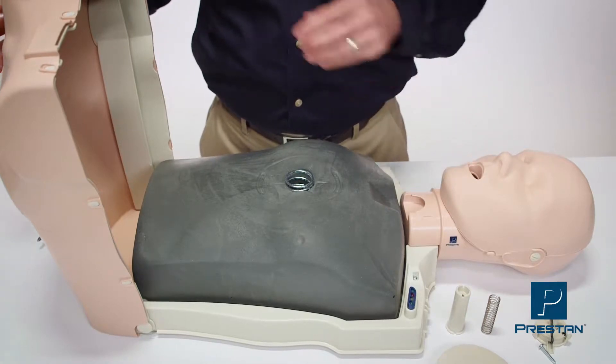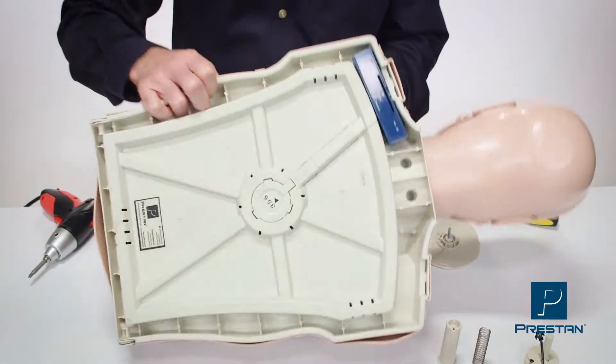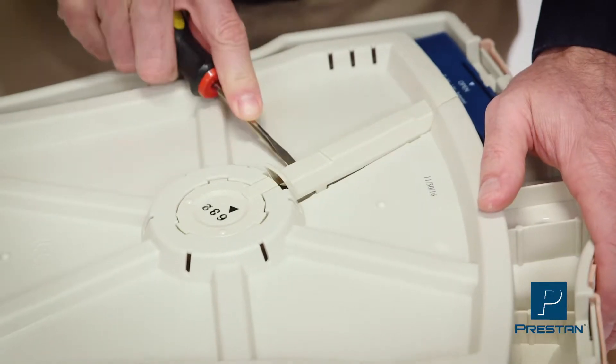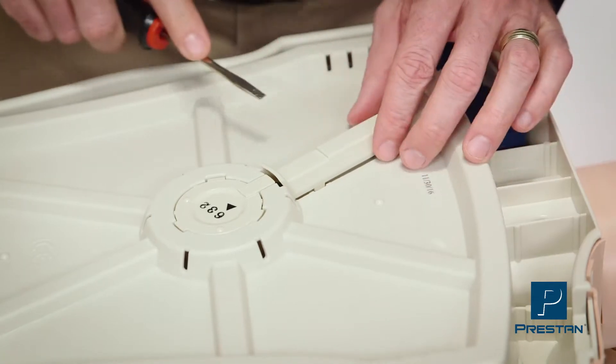Next, turn the mannequin over and pop off the wire cover using a flat edge screwdriver.